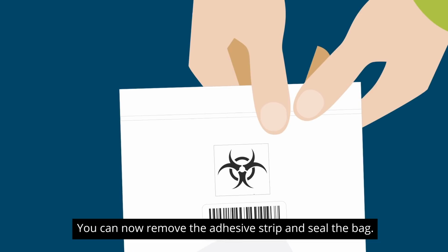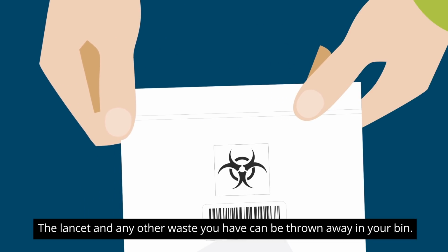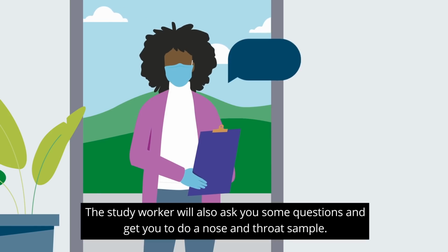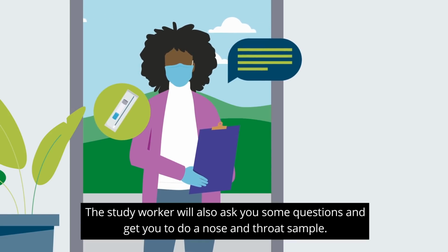You can now remove the adhesive strip and seal the bag. The lancet and any other waste you have can be thrown away in your bin. The study worker will also ask you some questions and get you to do a nose and throat sample.